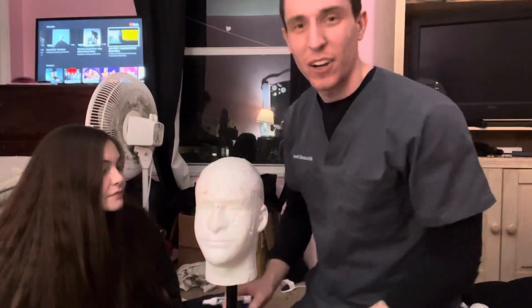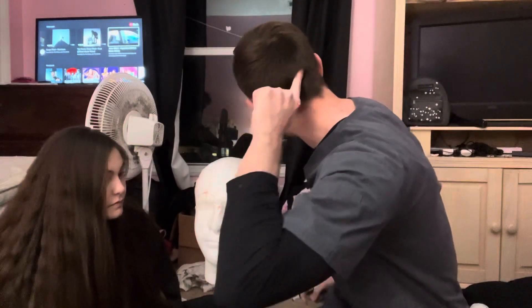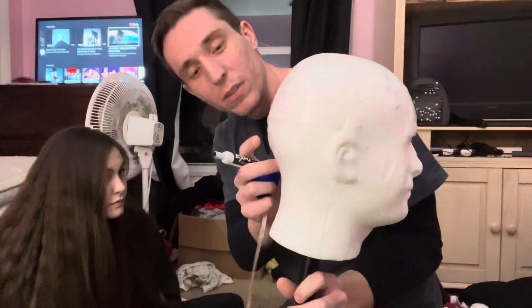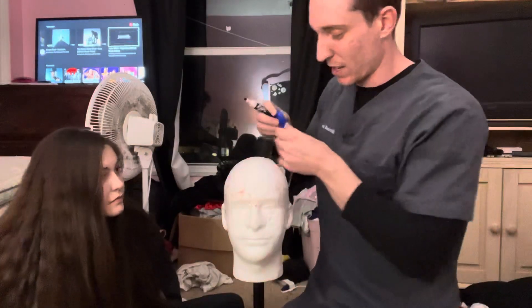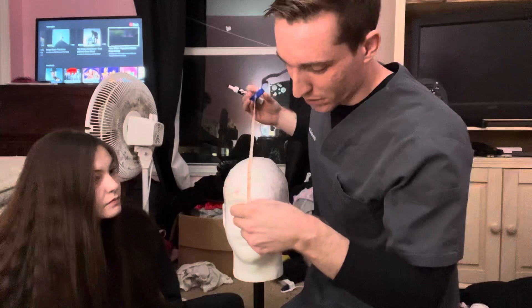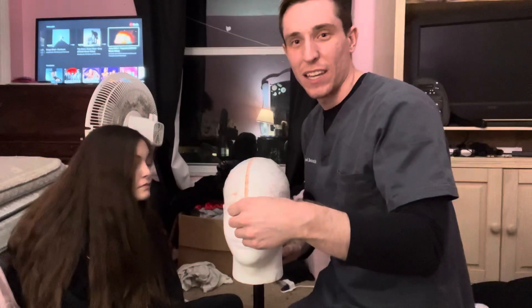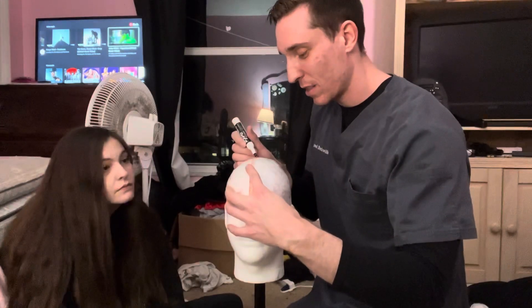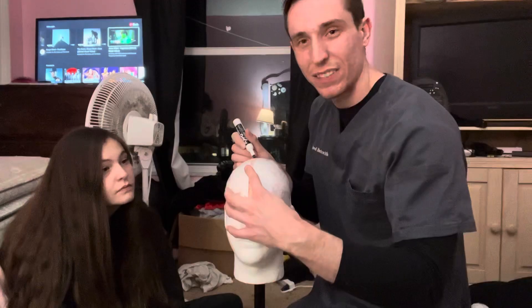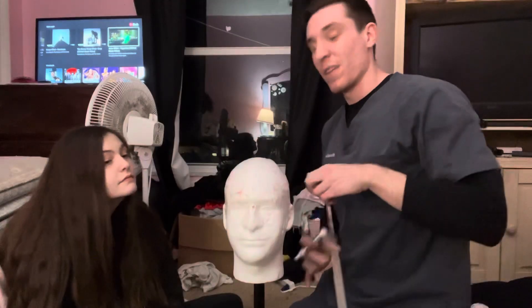The first things you need to know are where do you start measuring from. You start from the nasion, which is right here on the bridge of the nose, all the way back to the inion, which is a little bump in the back of your head. I go from the nasion to the inion and I get 34 centimeters. The first thing I do is mark in the middle — half of 34 is 17 centimeters — just as a landmark so I know where the middle of the head is.